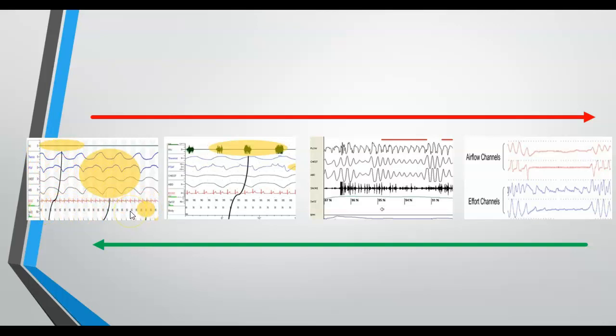As you start gaining weight, you may start having some snoring, but the flow remains normal. If you don't do anything about that, and you keep gaining weight or increasing in age, it may become a hypopnea, with reduced flow, causing desaturations. And even at that time, if you didn't do anything, it may end up in an obstructive event. So this is a continuum as you go this way.